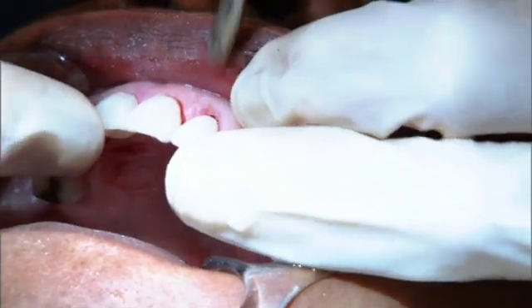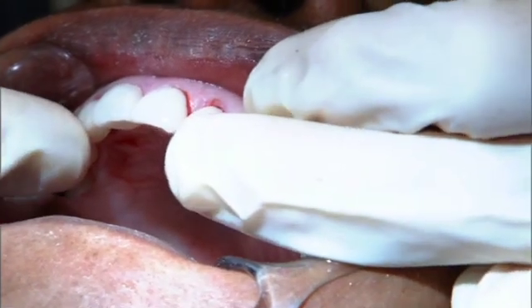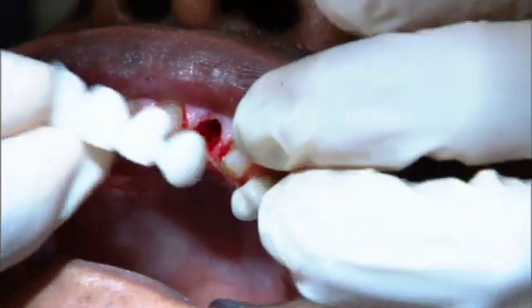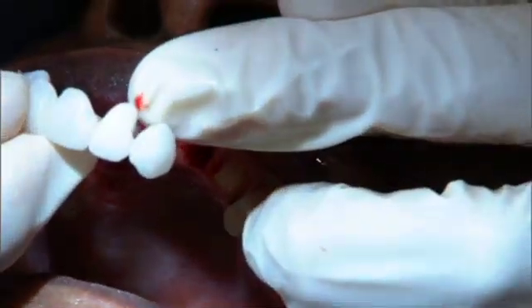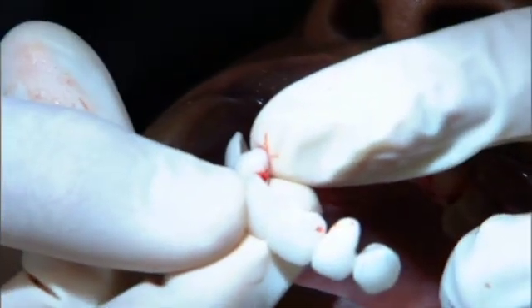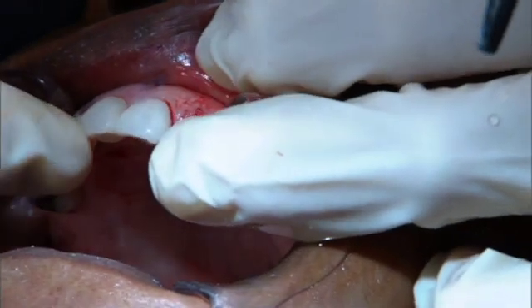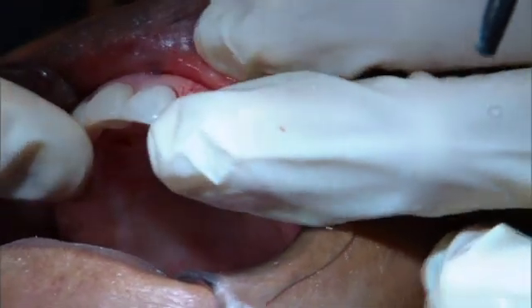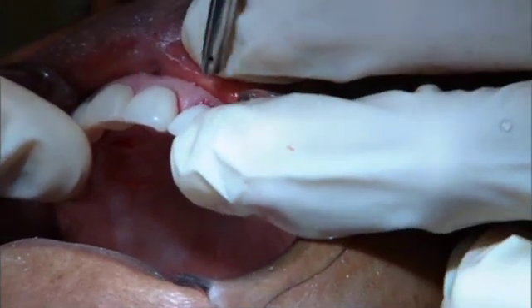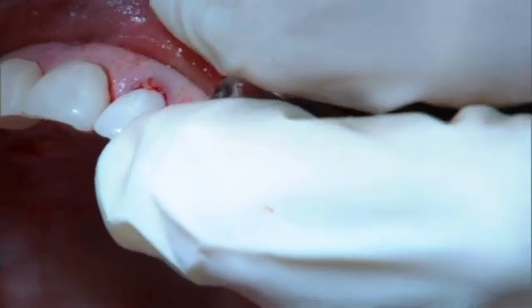I can quickly try my provisional bridge in and see how close we are in terms of prep and prep design, and I can make any changes that we're going to need to make. If you'll notice in the provisional, we've got a nice pontic form that will help to support the hard and soft tissue so that while she heals, we'll create a bed for a pontic. The lab has just used their knowledge, skill, and judgment to get this as close as they can for me, and they're really very, very close.